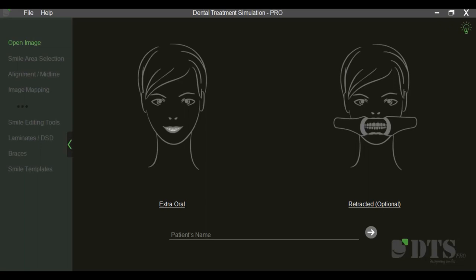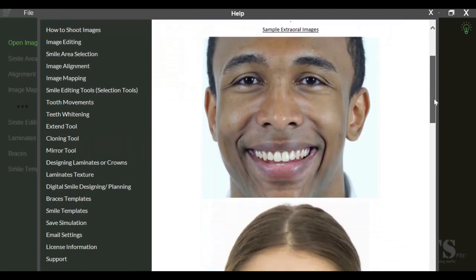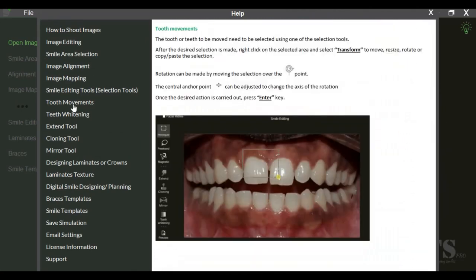Welcome to the functionality overview of DTS Pro, a revolutionary one-of-its-kind dental treatment simulation and digital smile designing software. DTS Pro has a quick and easy-to-use interface that guides the user at every stage, right from photography protocol to carrying out different types of simulations.